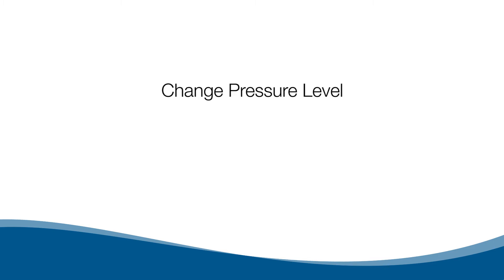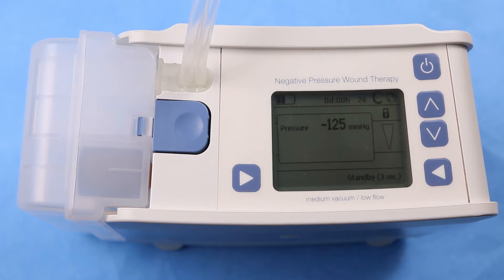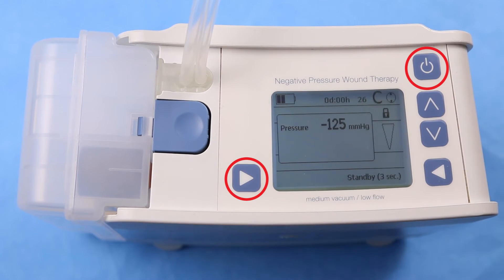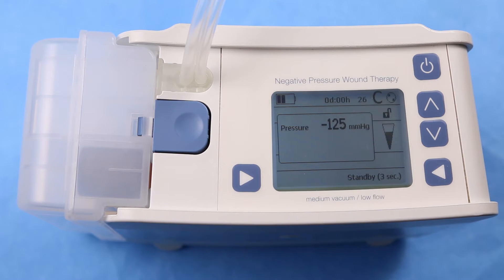To change the pressure level, the pump must be placed in administrative mode. To enter the administrative mode, press and hold the bottom left button and press the top right button. The lock on the screen will be in the unlocked position when the Envia Liberty pump is in the administrative mode.